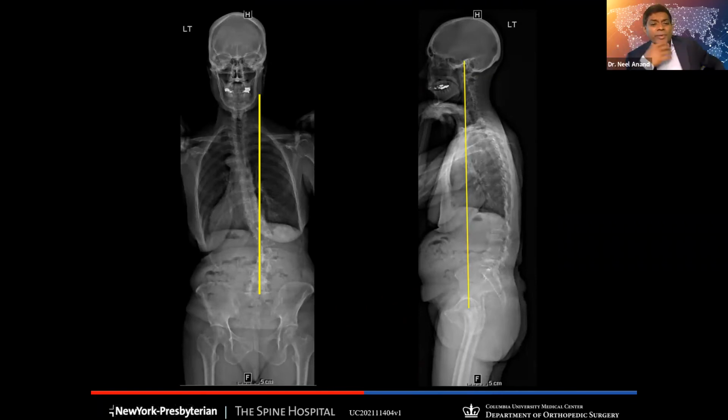What we do, I still use a staged approach here, multi-level lateral, single position. We've just gotten very comfortable with it, but I agree, you can do anything you want. In our hands, a multi-level lateral approach, L5-S1 to L1-2, and then posteriorly all MIS again, probably T10 to pelvis. And usually we stage it because it helps us evaluate the thoracic component, and I think that's been very, very useful of late. I think it's a great point.